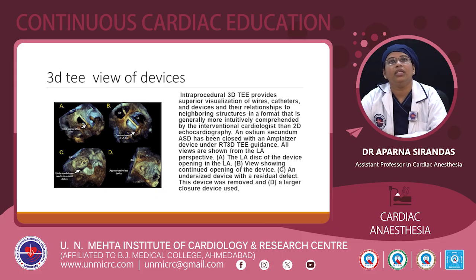And this is the 3D TE views of the devices. So, intraprocedural 3D TE view, it provides superior visualization. In this you can see wires, catheters and the devices in their relationships to the neighboring structures in a format that is generally more intuitively comprehended by the interventional cardiologist than 2D echocardiography.